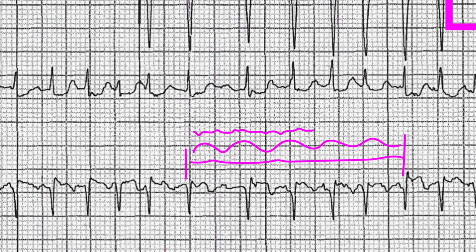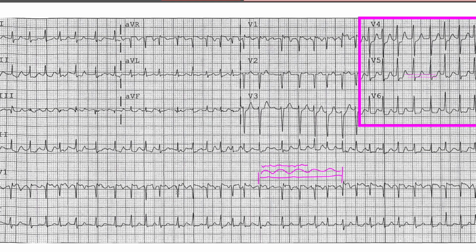You have the tools in front of you. Don't cut yourself short. Don't be happy with just getting the ECG done and passing it on. You have the tool in front of you. Use it to its maximum potential in order to make your job easier. Okay?